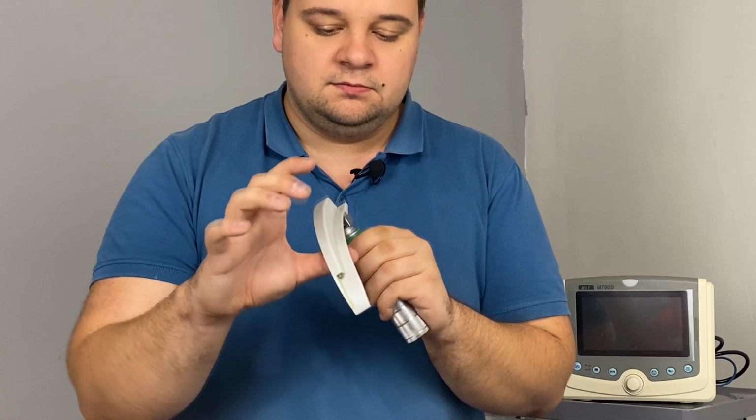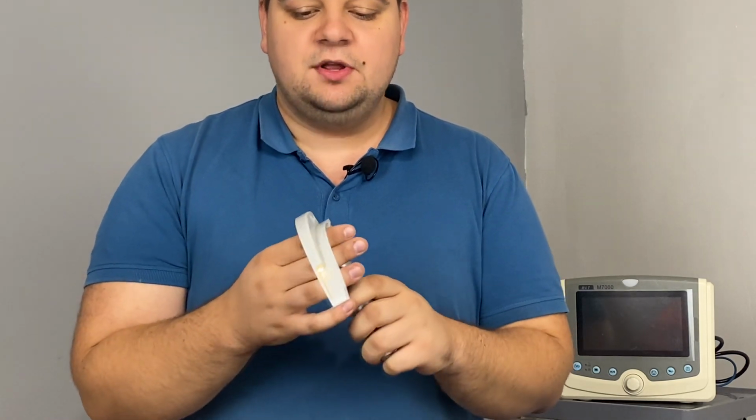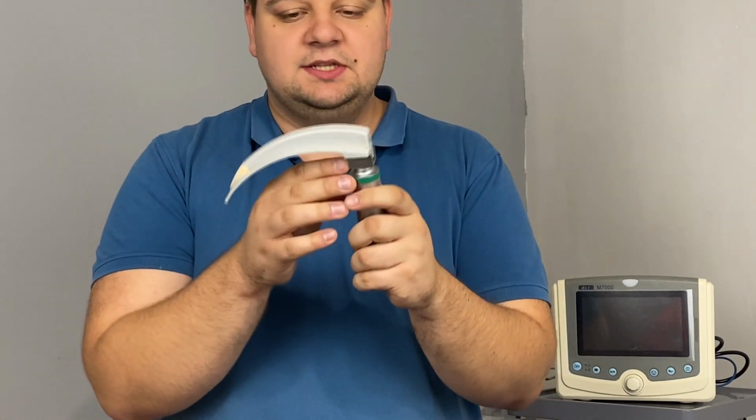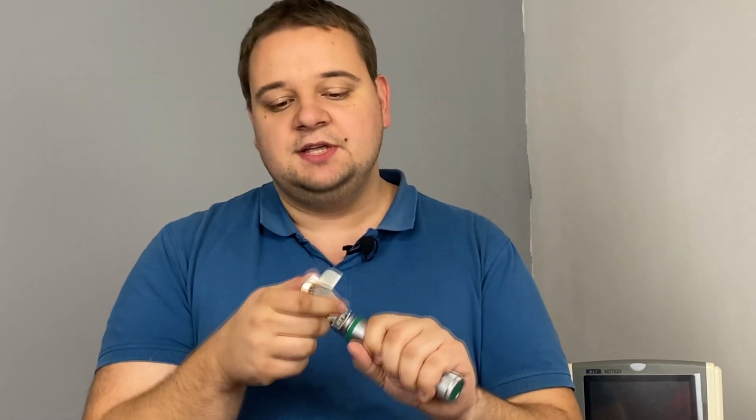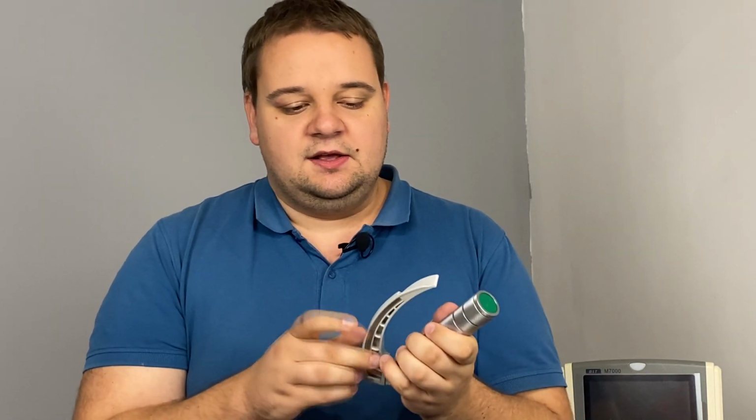Then when you turn it on by just opening the blade, you start to see the light, because it's dark inside the patient and you do need to see the light. In some devices, it's not only a light but a camera, and they're called video laryngoscopes, where you don't have to look inside the patient, but you see everything on the screen.